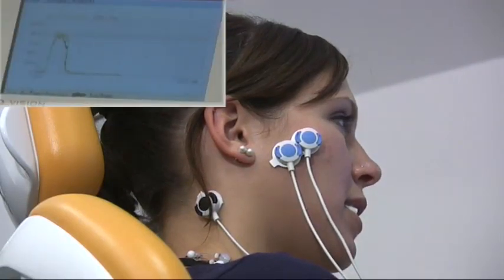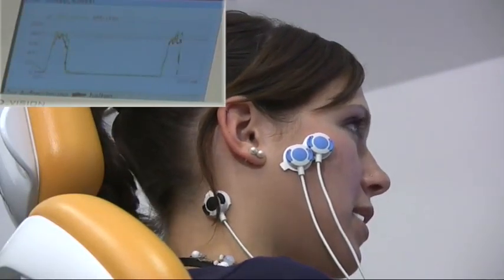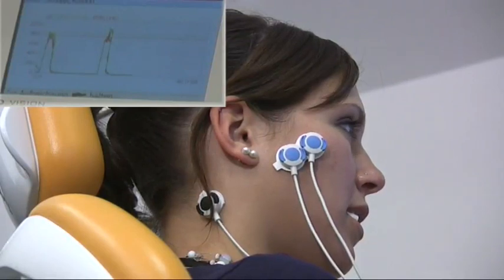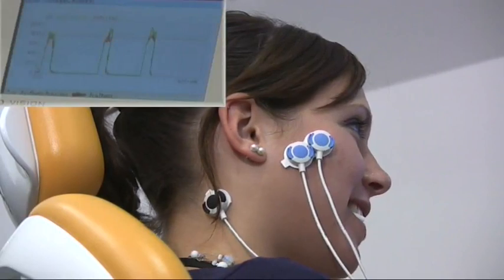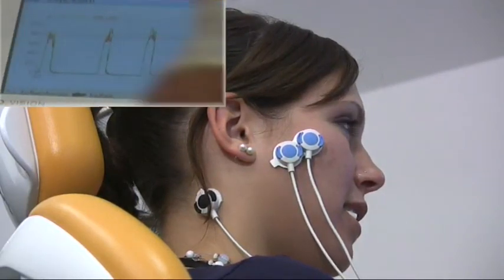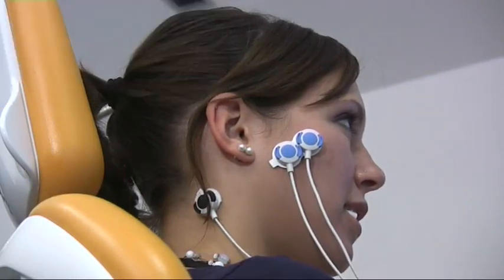Immediately, complete relaxation sets in. It goes down to a very low level. Now, bite down hard once again and relax. Bite down hard once more and relax. A very low activation potential is also immediately achieved. Immediately, complete relaxation sets in. It goes down to a very low level.